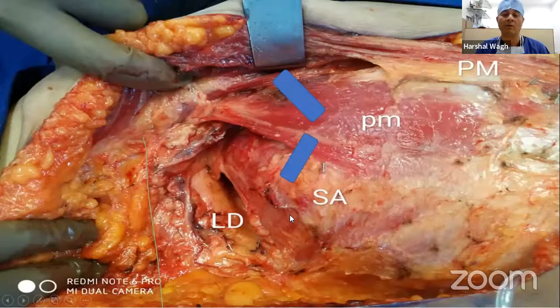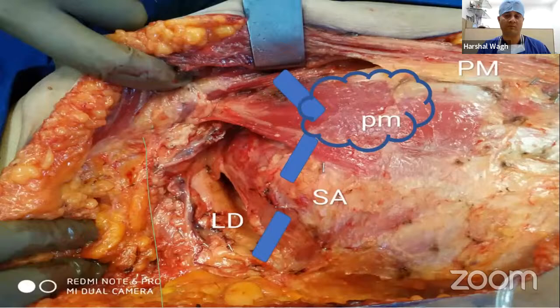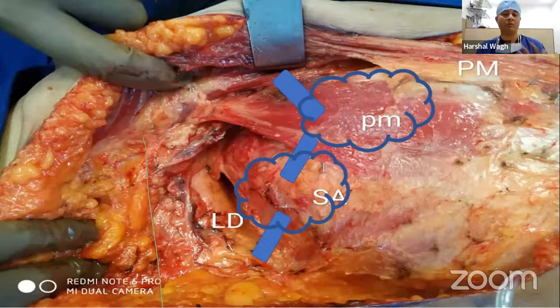When I put local anesthetic here, between the pectoralis major and minor, it becomes the interpectoral nerve block. When I put local anesthetic there, it's either a PEC 2 block, which is between the pectoralis minor and the serratus anterior, or, if you have enough local anesthetic, it can be a superficial serratus plane block. If you put it below the serratus, then it's going to be a deep serratus plane block.